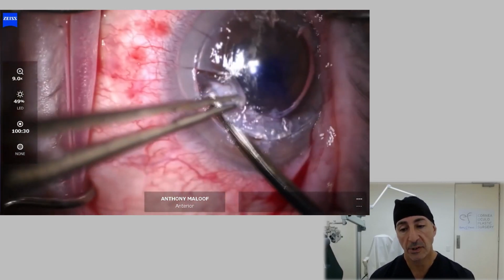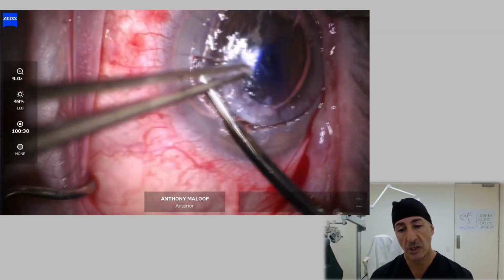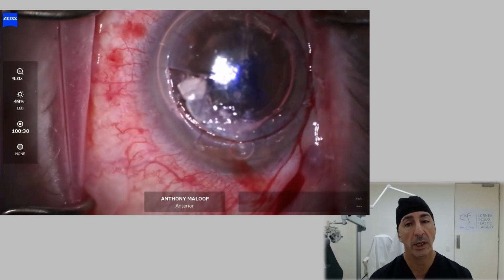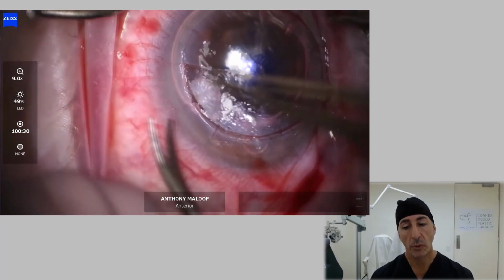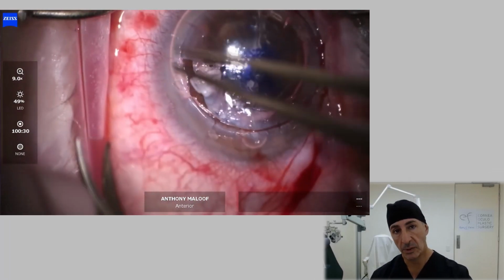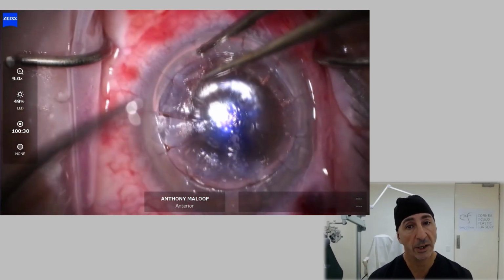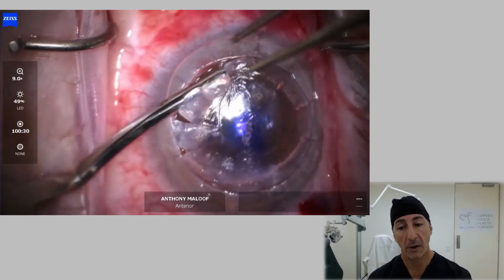So I'm going to have a careful dissection. Now right here where you see me start at this edge, it perforated. One of the incisions had gone through. So suddenly I've got to dissect a cornea that goes flat. So I'm putting air in the eye. I'm putting air alternating with saline. I want the endothelial cells drunk with saline. I don't want them dry on a vine.